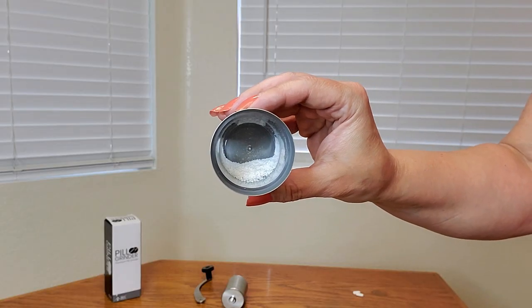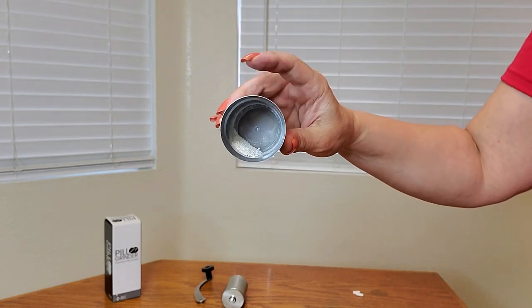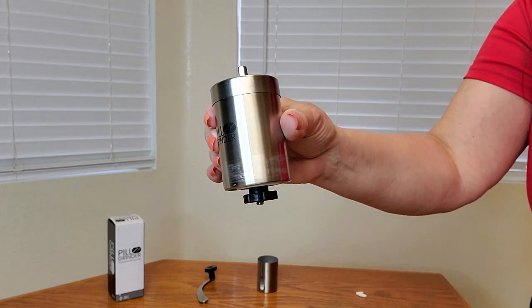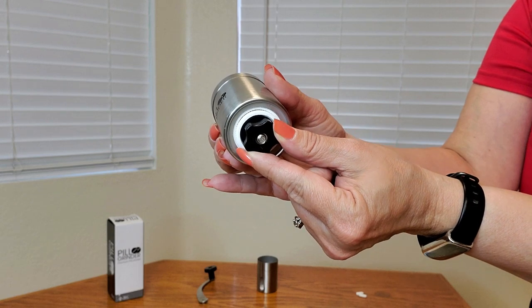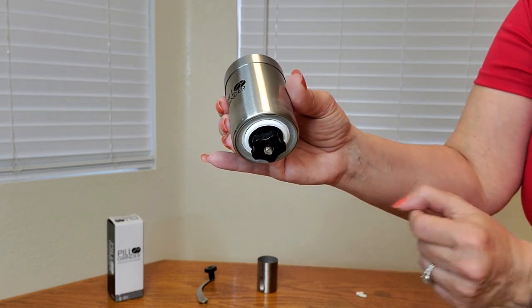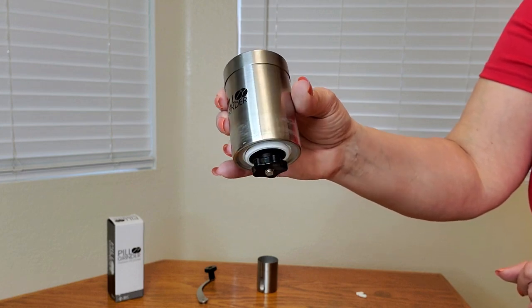Let me show you close up. As you can see the pills are all ground up — very powdery indeed. Does the job very well. And this is what the bottom looks like. It has the ceramic grinder and you can adjust the coarseness by rotating it to your desired liking, whether you want it finer or coarser.